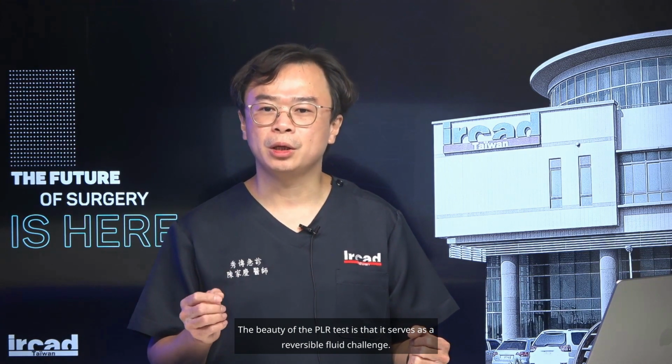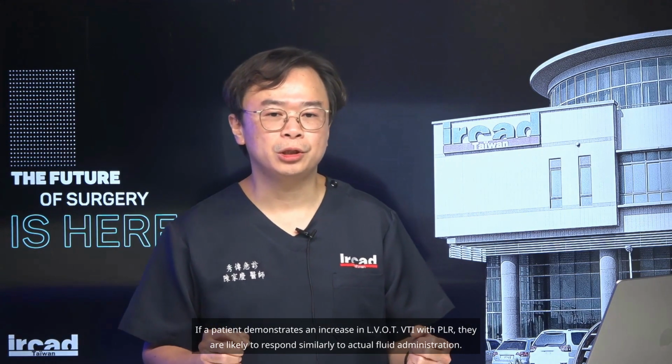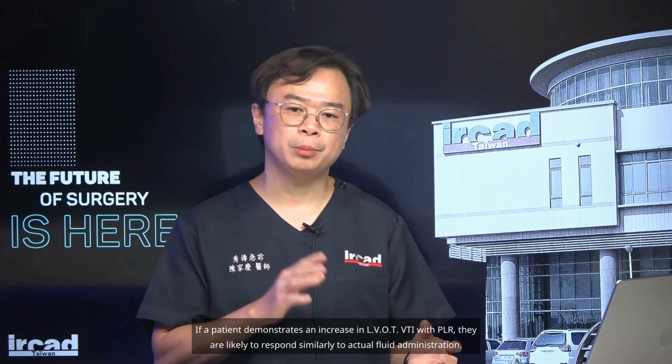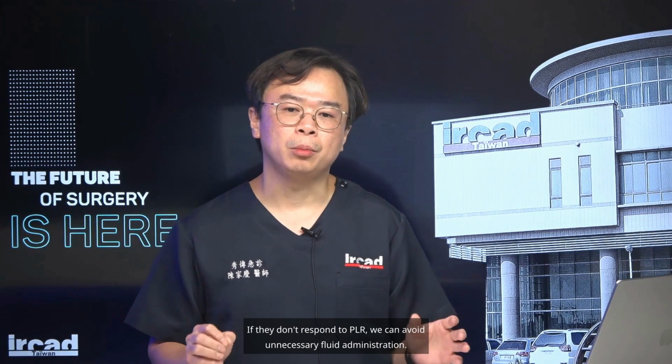The beauty of the PLR test is that it serves as a reversible fluid challenge. If a patient demonstrates an increase in LVOT VTI with PLR, they are likely to respond similarly to actual fluid administration. If they don't respond to PLR, we can avoid unnecessary fluid administration.